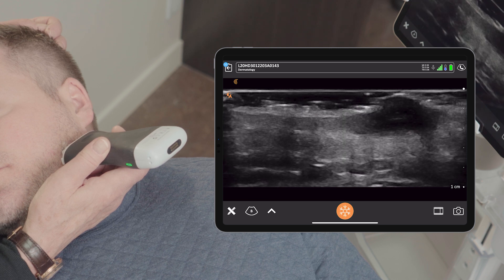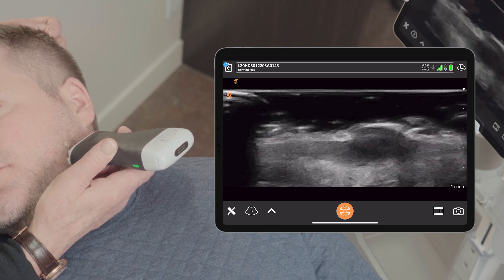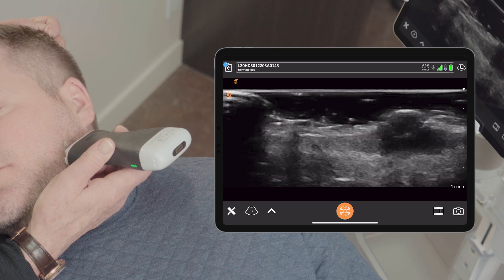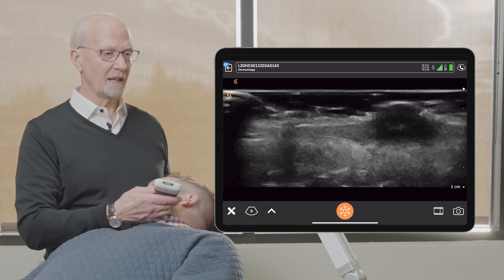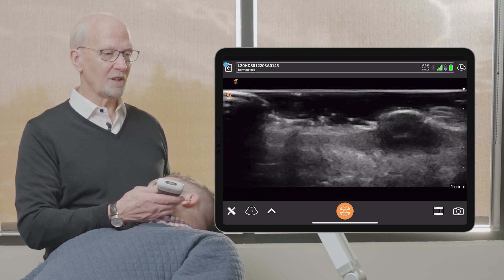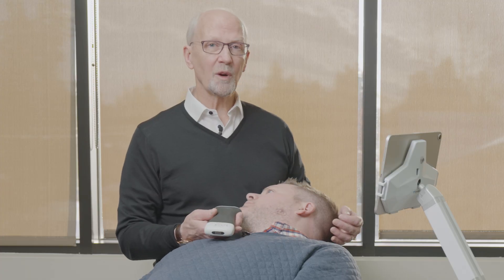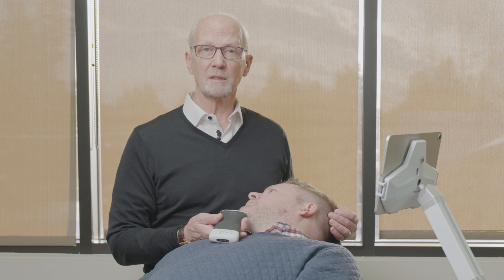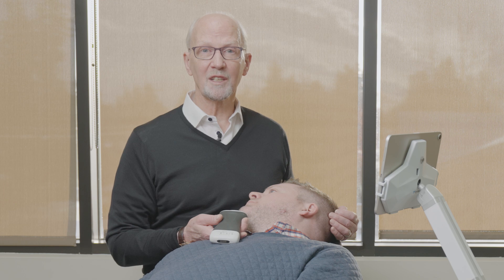Unfreeze. We can come back to it and we can see actually where there's a little ostium that goes up to the surface of the skin. Here with our Clarius L20 new HD3, we have great visualization of the lesion, which is limited to the dermis — we know it doesn't go any deeper than that. So we can have a clear idea when we go in and do our excision of how much tissue we'll need to remove. This gives us a better idea of what we're dealing with and lets us be much clearer with our patients, rather than saying 'I think it's this.' Now we can say we have a much better idea of what's happening and how we can approach treatment. That should be really helpful in clinical practice.